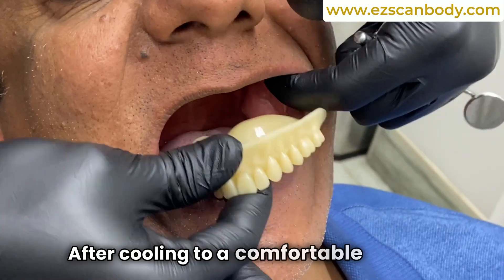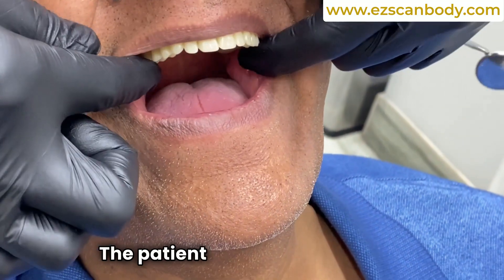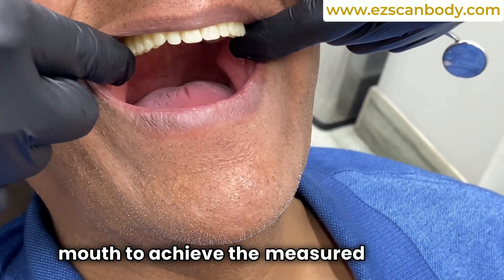The thermoplastic denture is then placed in hot water to soften. After cooling to a comfortable temperature, it is inserted into the patient's mouth. The patient closes their mouth to achieve the measured vertical dimension.